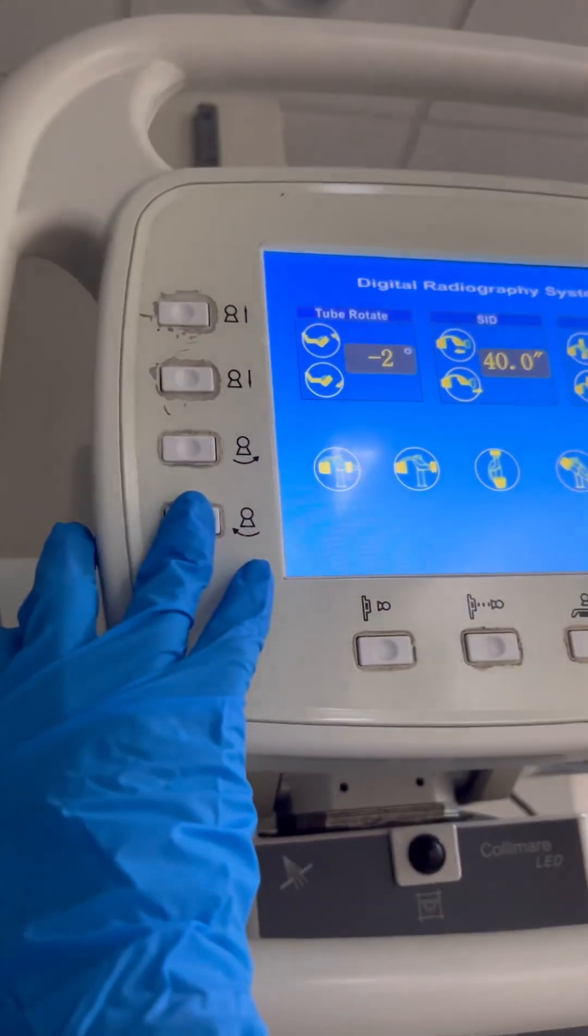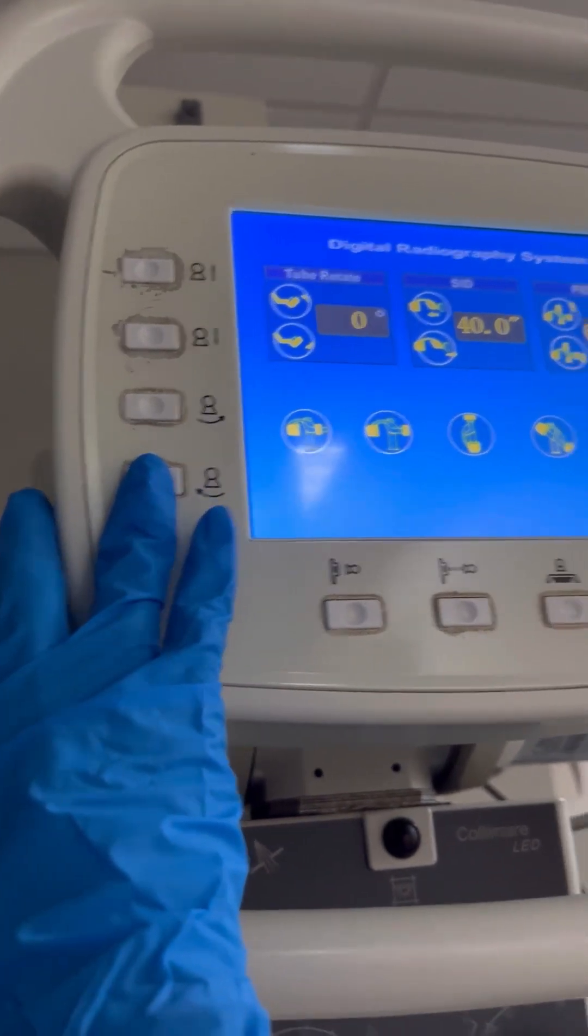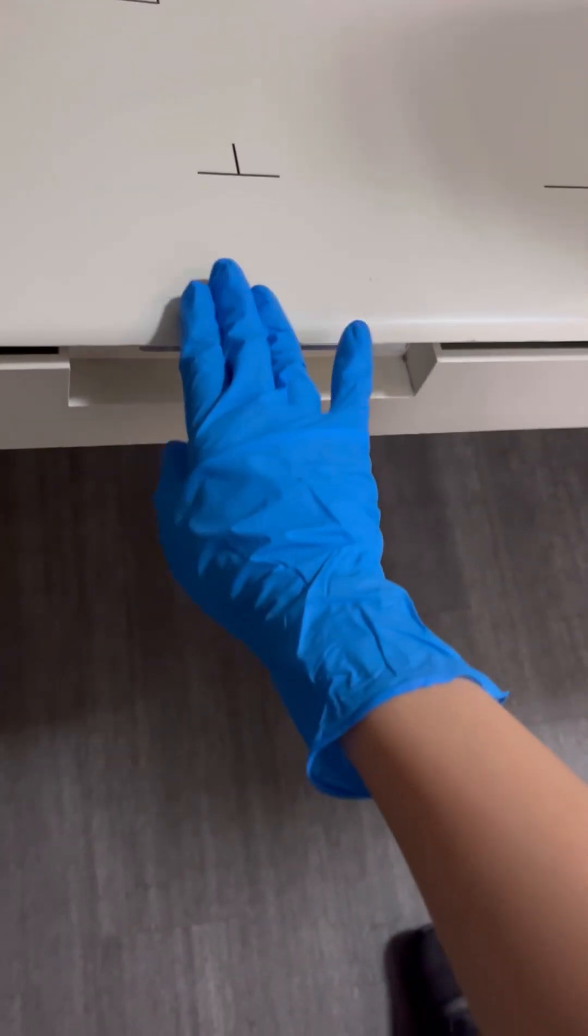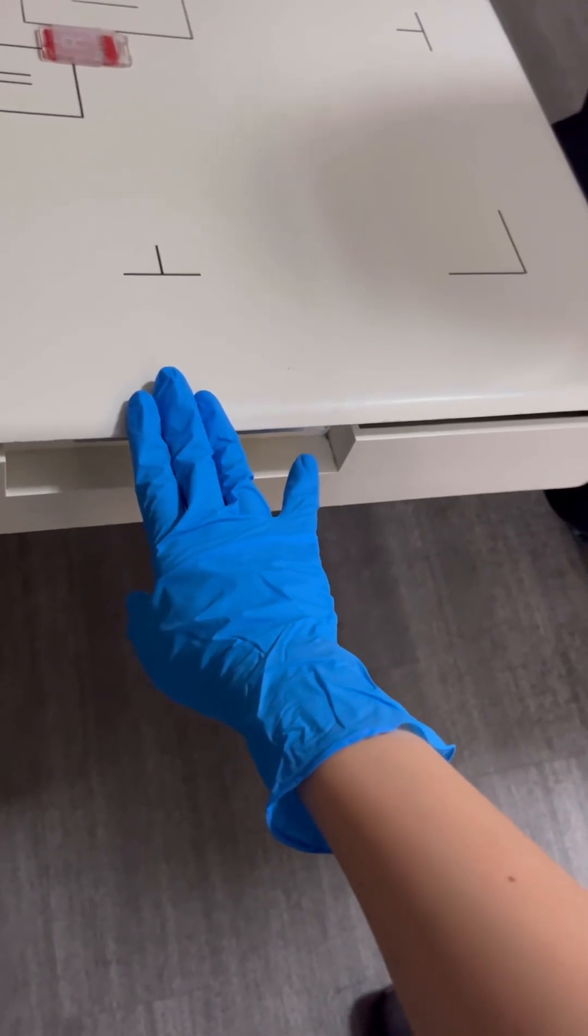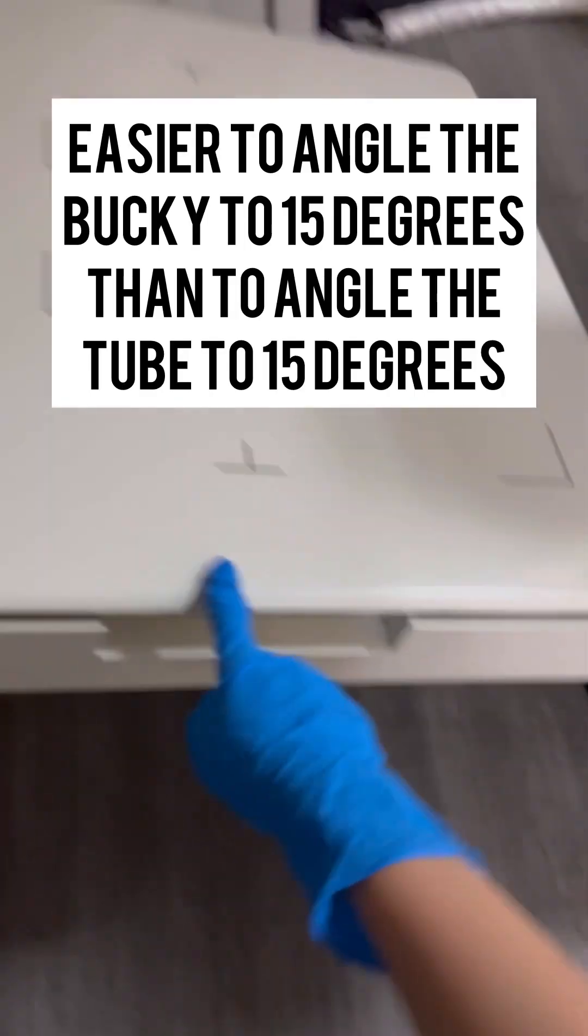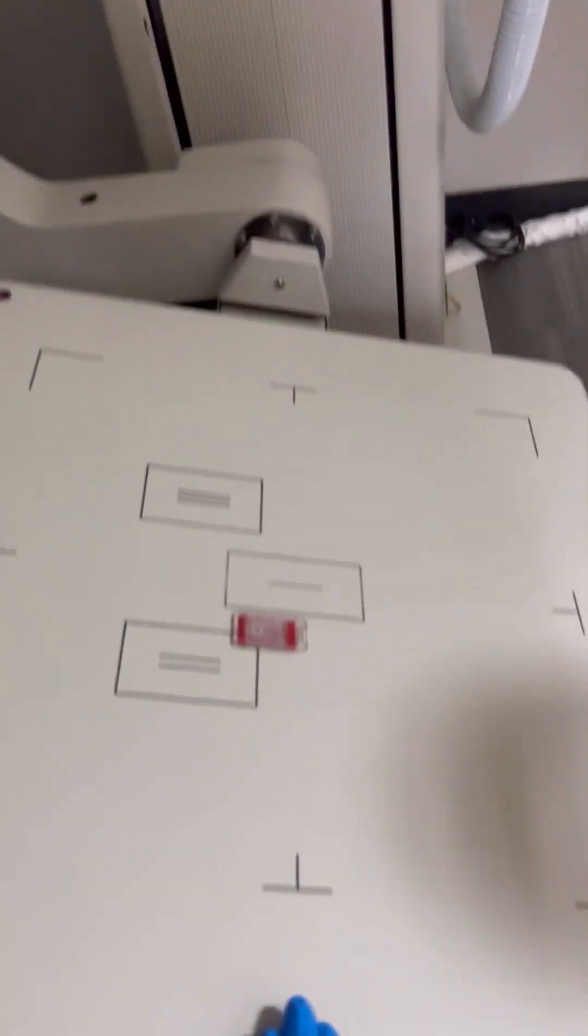If we just put this to zero degrees, this will give you that 15 degree angle. So it's easier just to move this instead of moving the entire thing. This is why I like to do it like this.